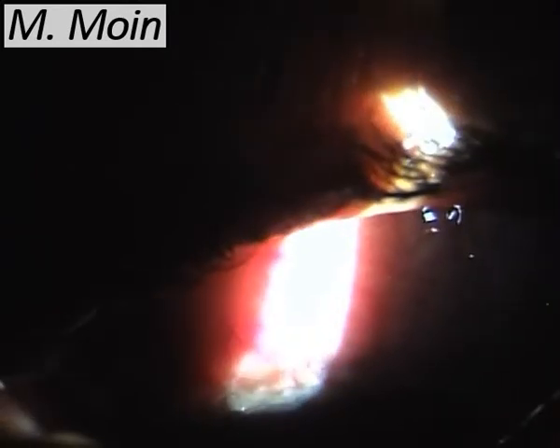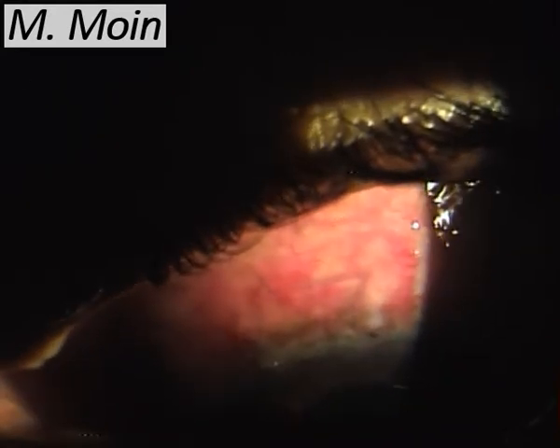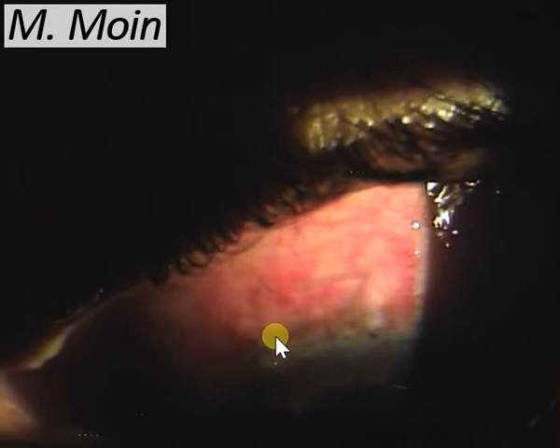Now looking at that bleb over here, what you want to see is, if the bleb is formed, how high is the bleb, how many clock hours the bleb is, and most importantly, does he or she have any Seidel positive, because the anterior chamber is shallow in this patient. For that, you have to go in and do a test with fluorescein just to show you where the trapdoor is. This is the trapdoor over here.